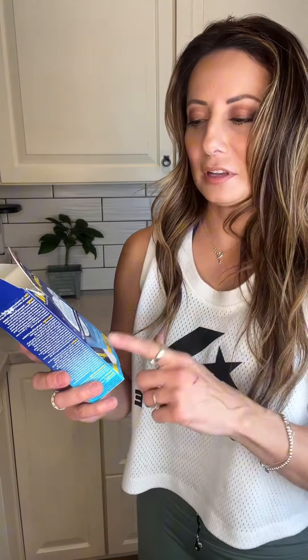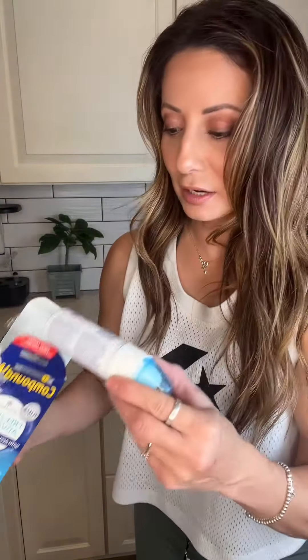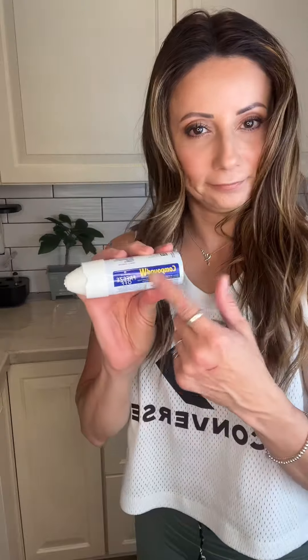We are trying this for the first time — it's Compound W Accu-Freeze Freeze Off Advance, and it's safe for kids, which is great because I'm using it on my son. I just want to show you what's inside this box. It has some instructions, and it has your Compound W Freeze Off — this is what it looks like right there. The icy cold applicator — you're going to watch us use this.